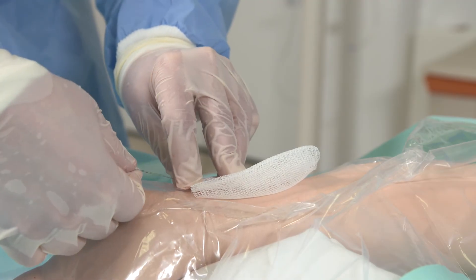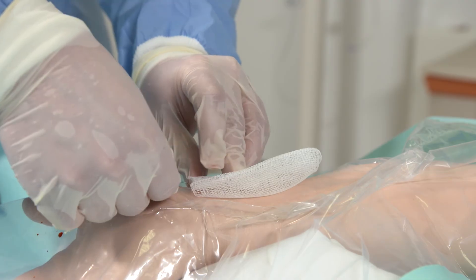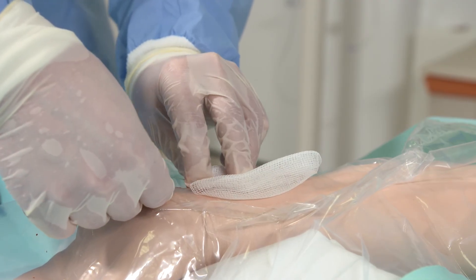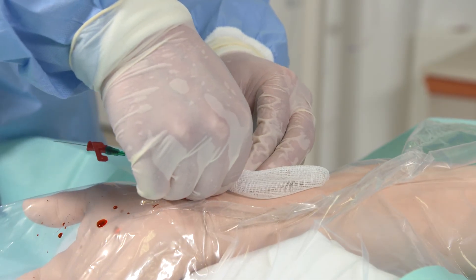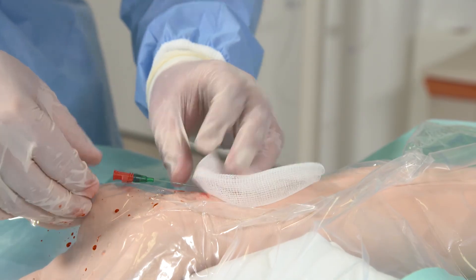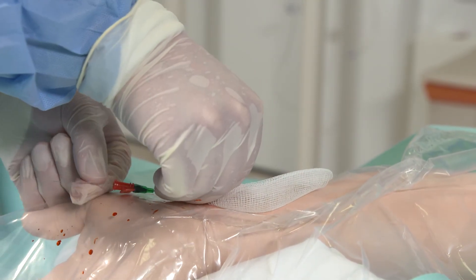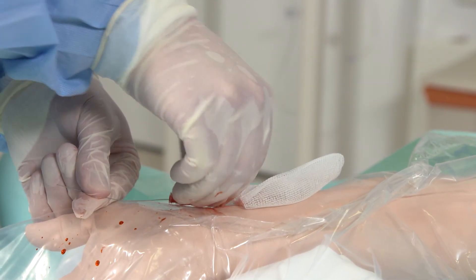Then thread the line over the guide wire, which can be tricky to do. The important thing at this stage is to ensure that there is plenty of guide wire visible from the end of the line, so you do not want to lose this in the patient. Insert the line over the guide wire, again keeping hold of it and ensuring that it is not lost in the patient.